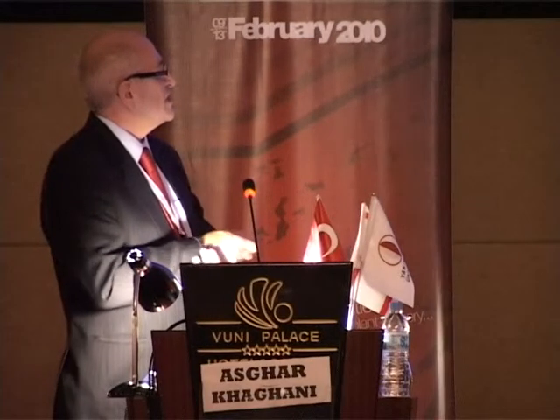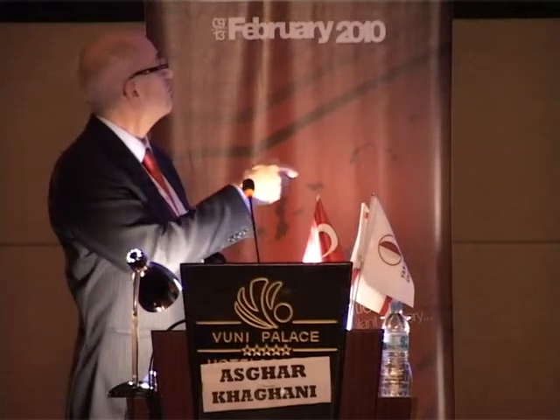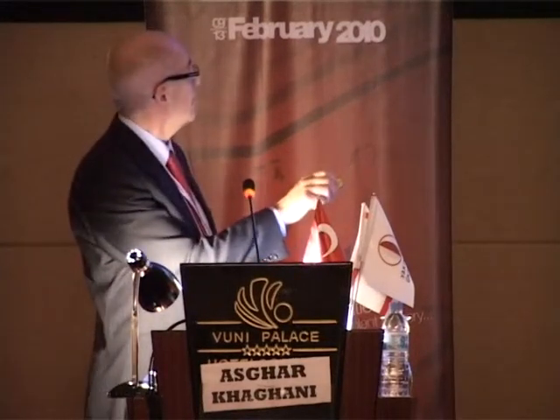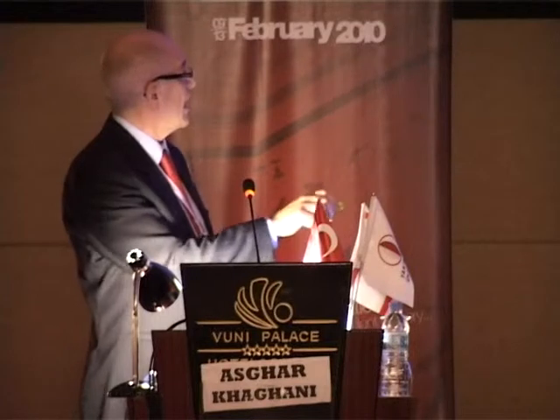There are limited incisions. This one is a second intercostal space. The femoral vessels are mobilized for cardiopulmonary bypass, and then we have got a section there. There is the second intercostal. We have got the apex. We have got the femoral vessels to be able to get to different sections, there, to there, and the cable.